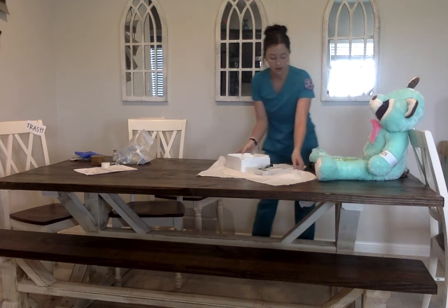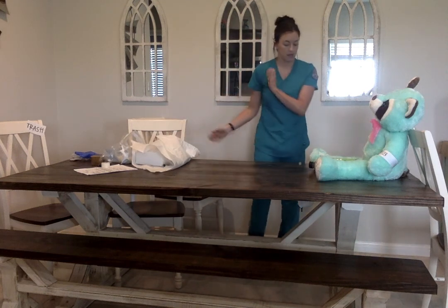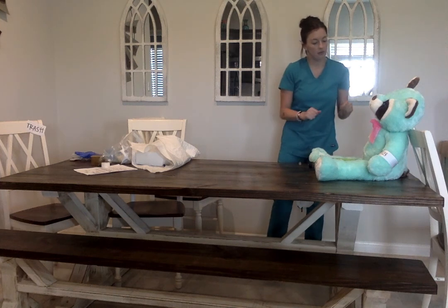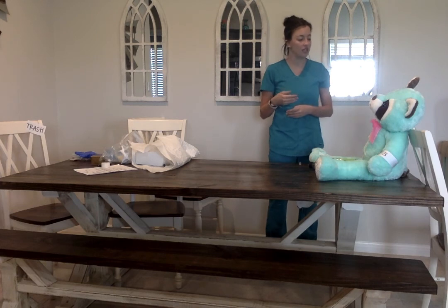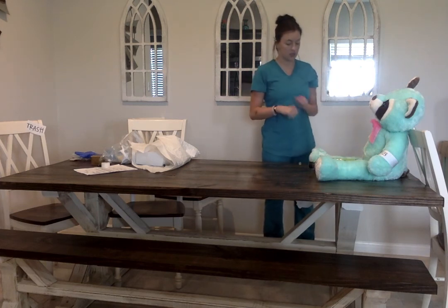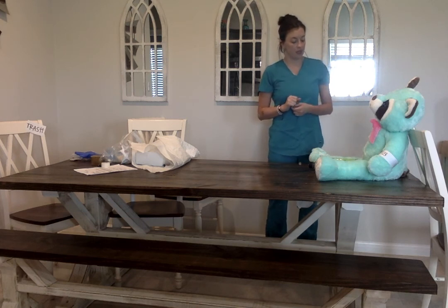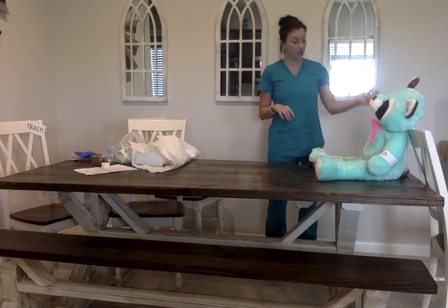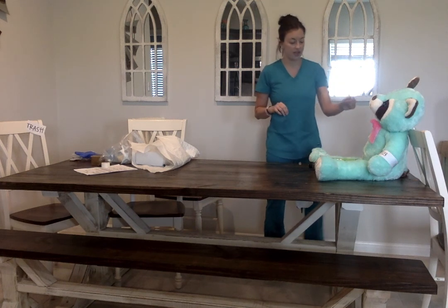There we go. Okay, Mr. Perez, I am done. I'm going to clean my hands really quick, cover you back up. Are you comfortable right now? Okay, do you have all your possessions? If you have to go to the bathroom, you're all hooked up and ready to go. And are you comfortable? Are you in any pain? Okay, great. Also, here is the call light. I need you to call me if you need anything. I'm just going to put it in your hand.